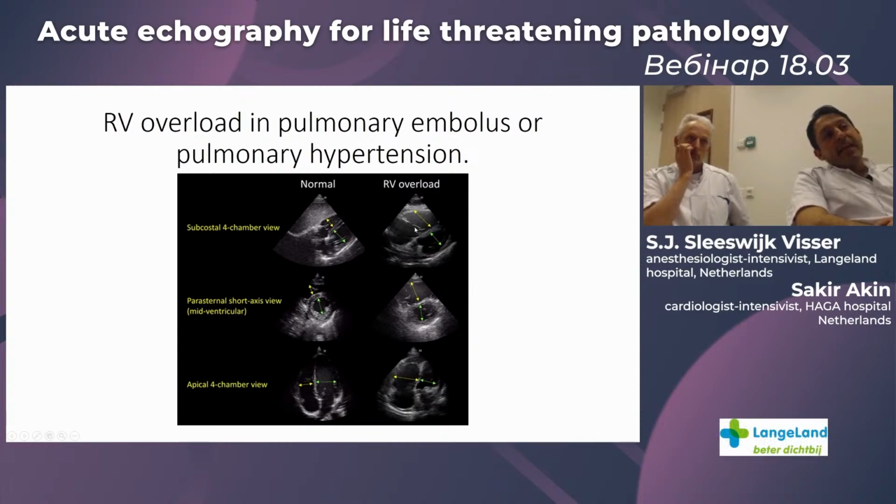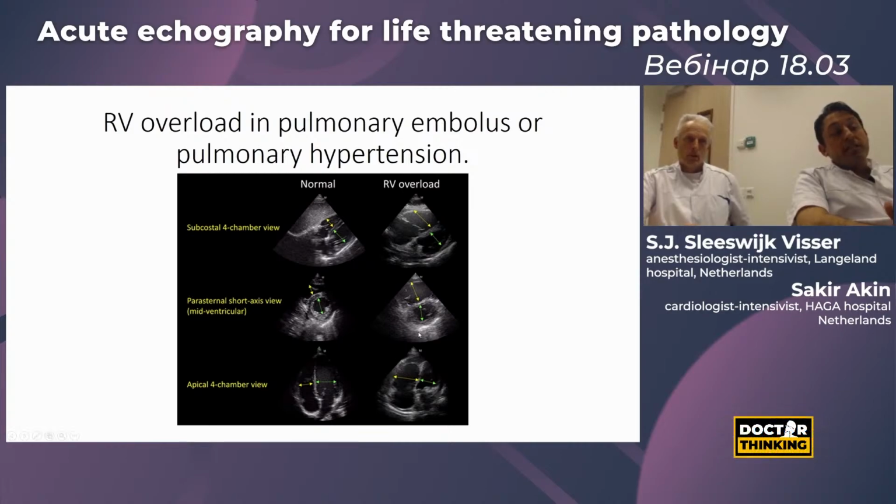If it gets 1:1 or even 2:1 in ratio, then you have to be aware that there is a pulmonary embolism, which increases the right-sided pressures enormously. And you see the dilated right ventricle, which also causes the D sign in the left ventricle, which prevents good left ventricle filling, good venous return, or left ventricle filling pressures to perform the cardiac output which is needed for your circulation.